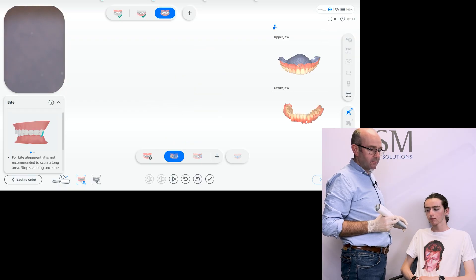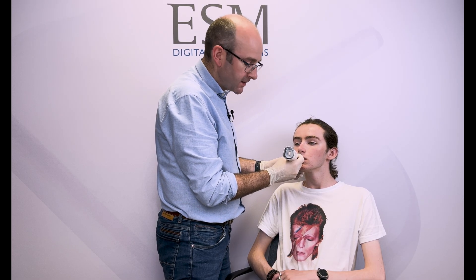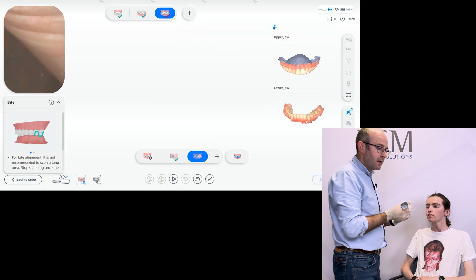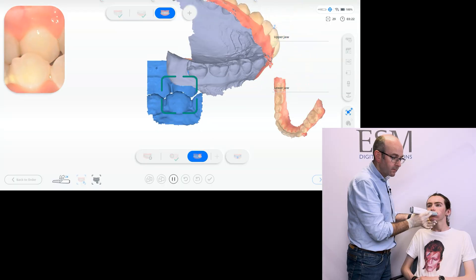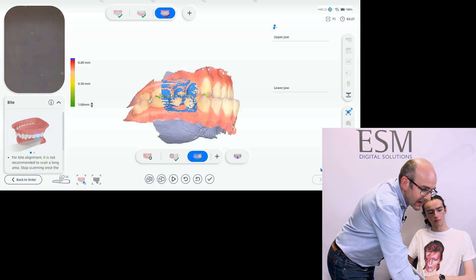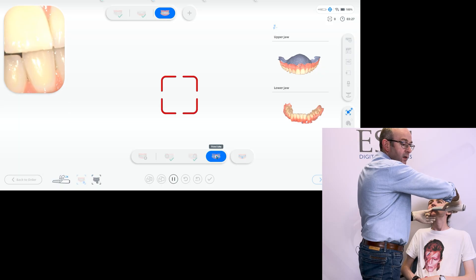Now we're ready to record the bite. Before turning the scanner on, we get the scanner into position — ask the patient to open up, get the scanner in position, and again use it as the retractor. Once in position, I stabilize the scanner and myself with my left hand, push the button to start scanning, and as soon as the software brings the arches together, push the button to stop. We do exactly the same on the other side. If needed — for example in a tricky anterior bite situation — we can click 'add one more bite scan' and capture an additional anterior scan.